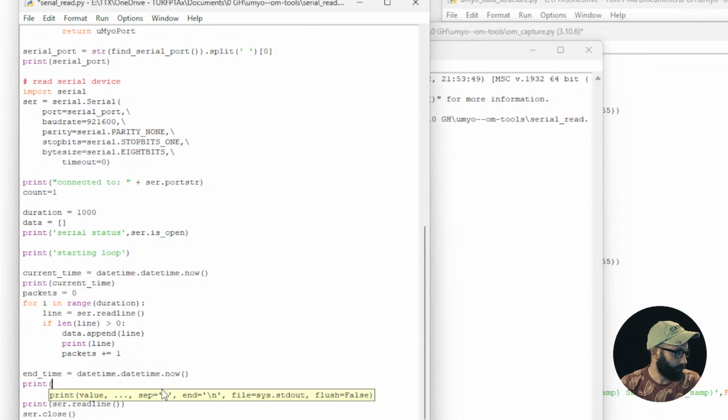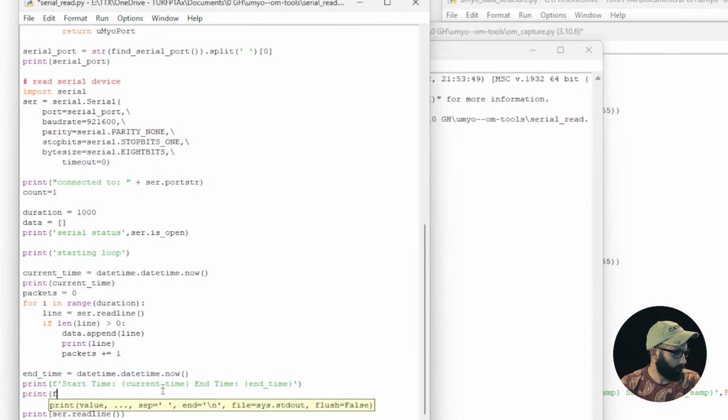We're going to print current time, or start time. Start time. End time. And then we want number of packets, which of course is going to be 1,000, which is, I don't know why I did this, but you never know, maybe it didn't calculate right, so we're still doing something.